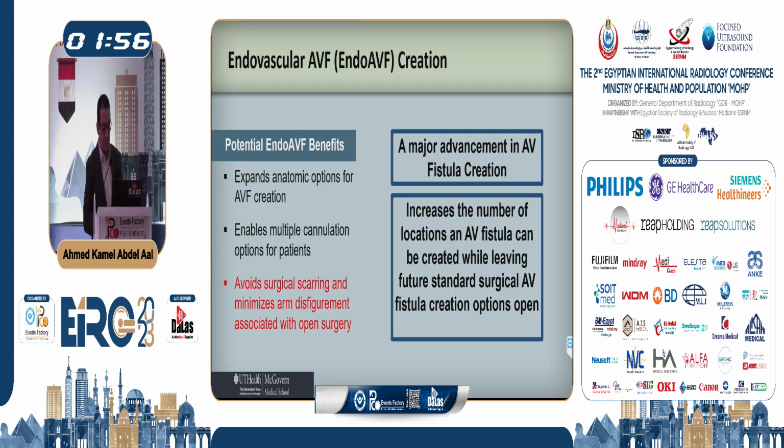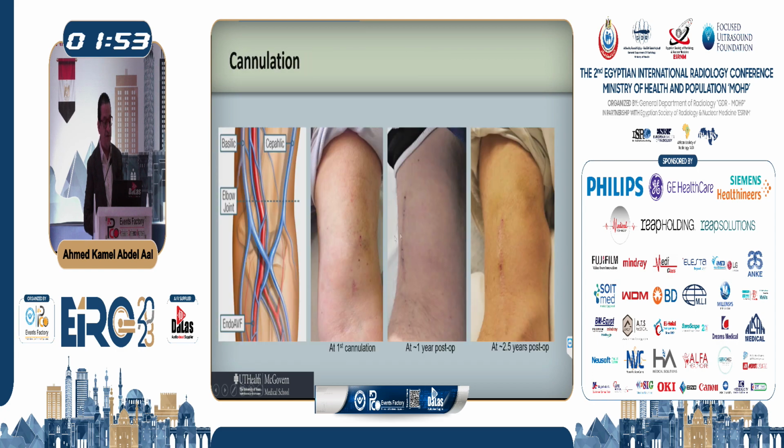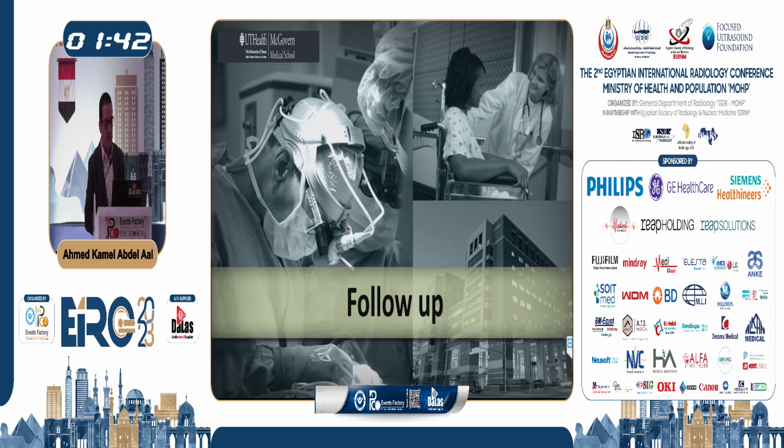The third one is to avoid the scarring and minimize disfigurement. This is after 2.5 years. You can see the patient's arm is not disfigured like we have seen in the earlier slides, where you have seen these aneurysmal dilatations in the draining vein.